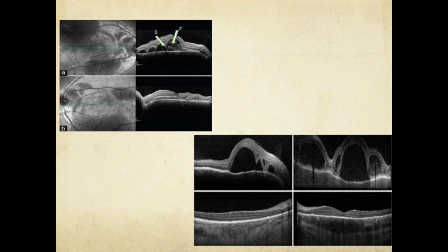Now I'll give you another example of a 57-year-old female who comes to you with bilateral diminution of vision associated with uveitis, poliosis. The patient also has AC cells of 3+, vitreous 2+. Then you see all of these findings. The patient also has tinnitus and dermatological alopecia and vitiligo. Yeah, exactly. So this could be a VKH as well.